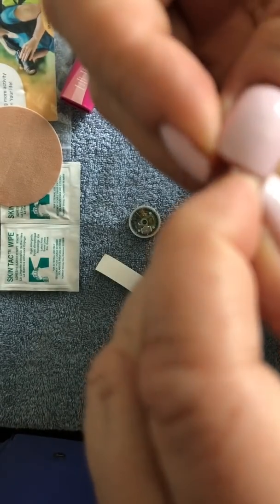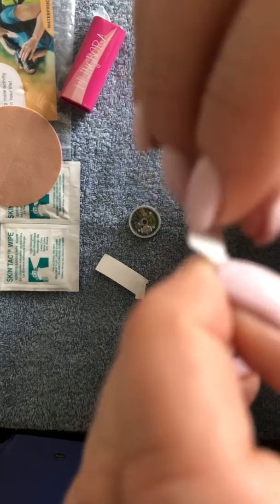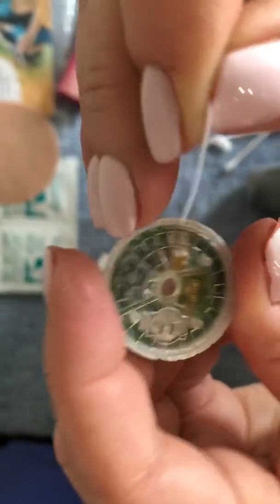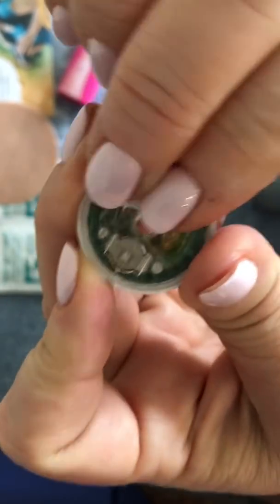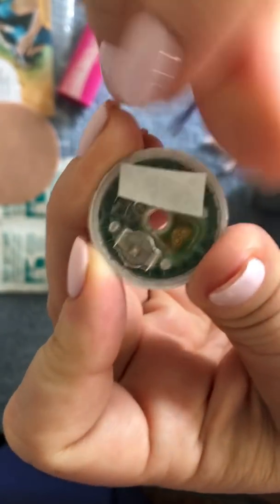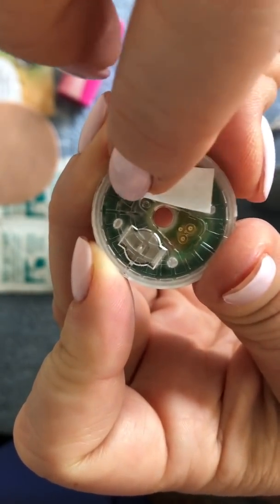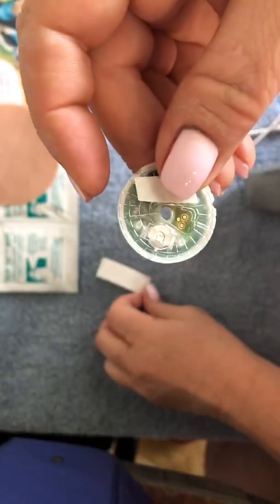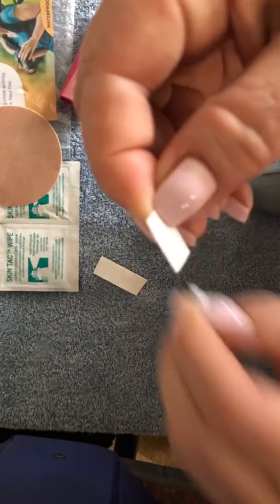So let me peel off the backing of one of them. Oh, I think I got it. Okay, so I got the backing, the double-sided tape is on that side. So you've got your little triangle here, and what I'm gonna do is I'm gonna put the tape right to the side of it, okay? And then don't forget it's double-sided, so there's other tape, another protector on here that we're gonna have to peel off. Then I'm gonna take the second piece of tape, and peel that off.